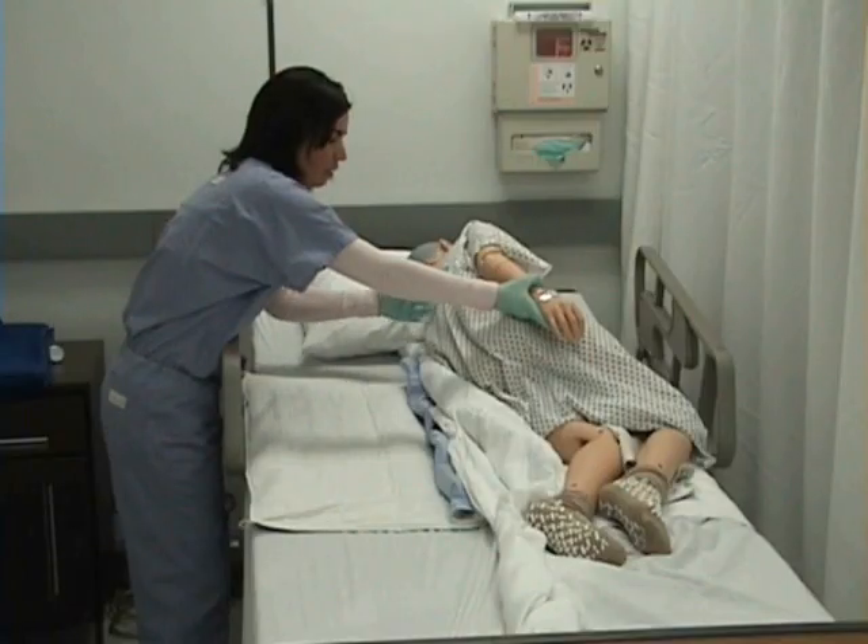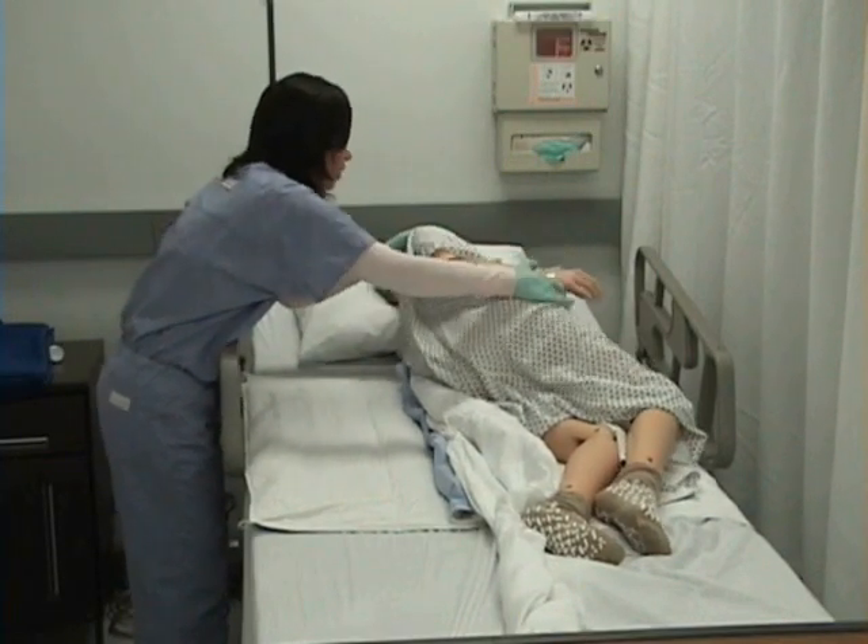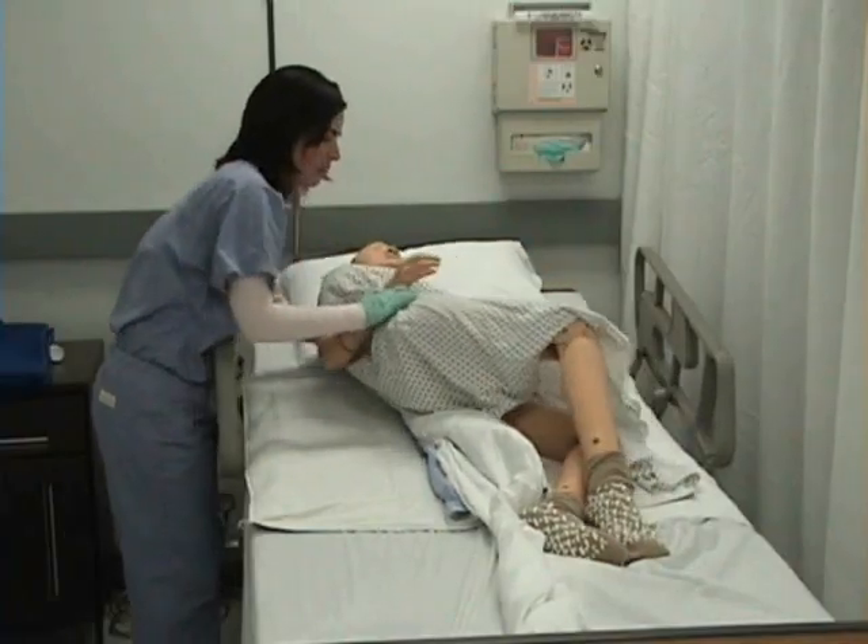Now I will assist my patient in rolling over in the bed over the lump of linen, and I will let her know that she's going to be rolling over a bump in the bed.